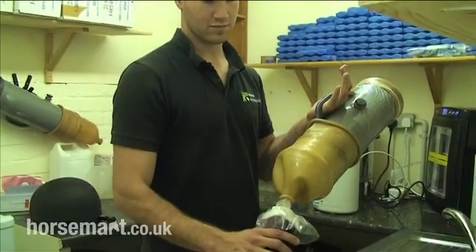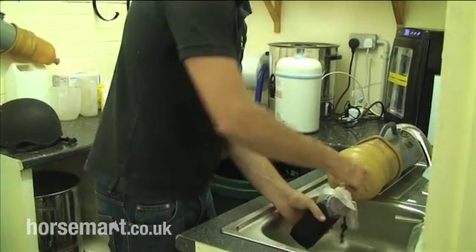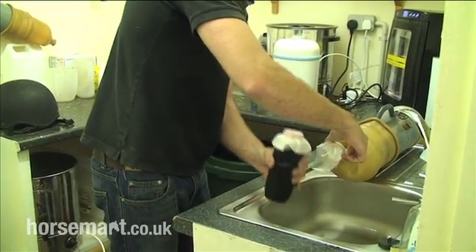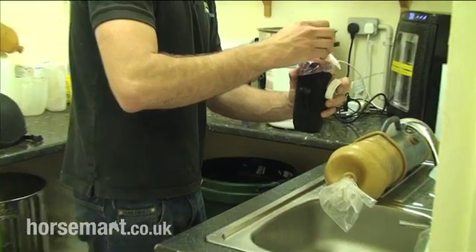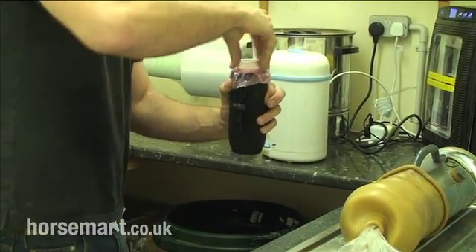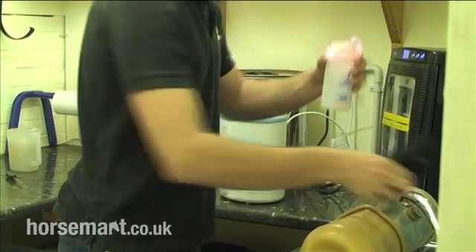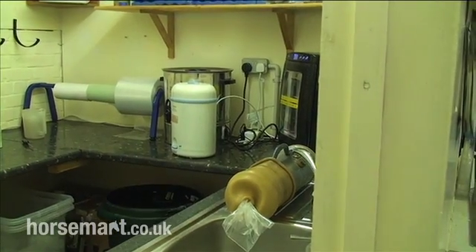We're in the lab now and Jamie's got the AV and the collection bottle. He's going to remove the collection bottle off the end of the AV. The collection bottle contains the semen. You can see it's got a filter on it to remove gel fraction and other bits caught in it. The cover on the bottle is to keep the sample warm — you don't want it to get cool. So there's our semen sample going into the lab.